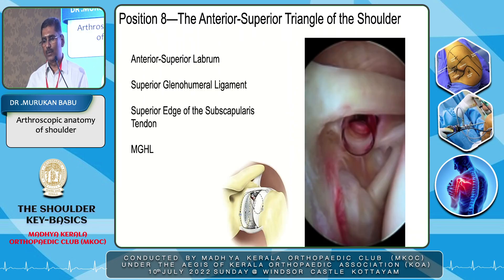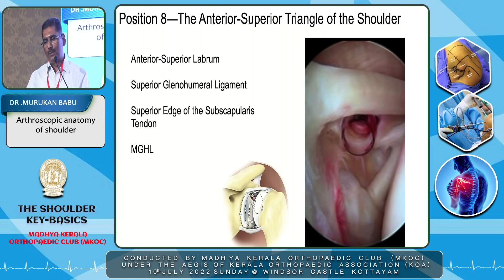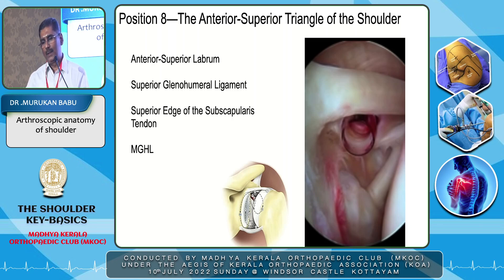Coming to the eighth position — that is an important area. Here you need to see four structures: the anterior superior labrum, the superior glenohumeral ligament, the superior edge of the subscapularis tendon, and the MGHL. The anterior superior labrum is not the superior labrum — it is the superior part of the anterior labrum. The superior labrum you have already covered along with the biceps tendon in the first position.